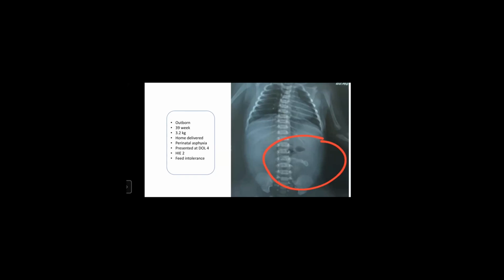So is this the shadow of the umbilical clamp? Okay. Well, the baby didn't have an umbilical cord clamp. Actually, it was tied by a thread when we saw it.